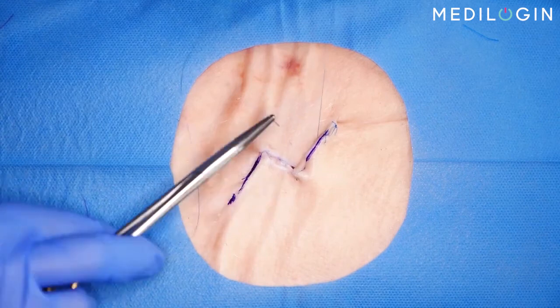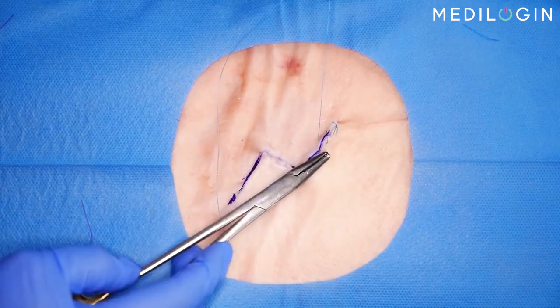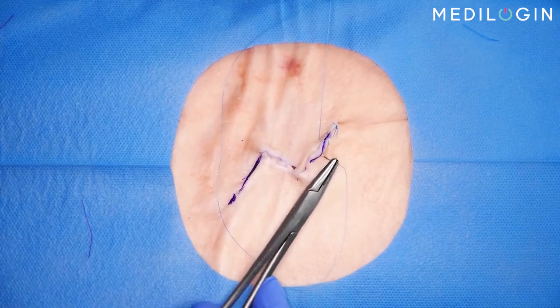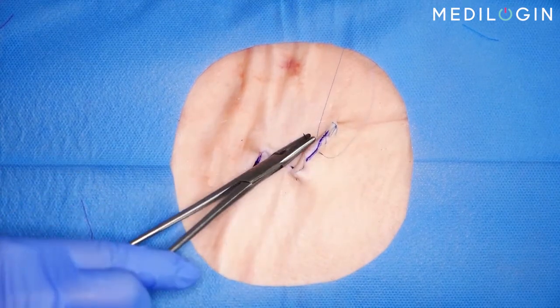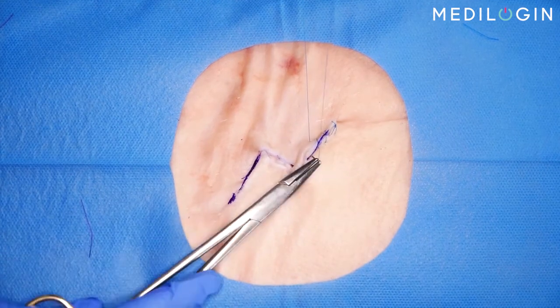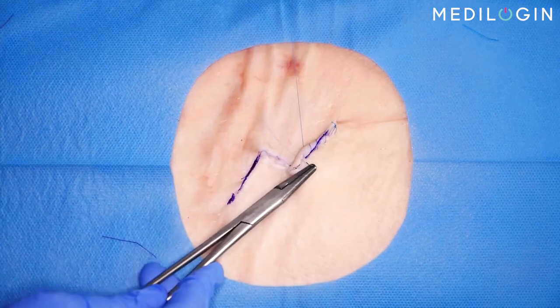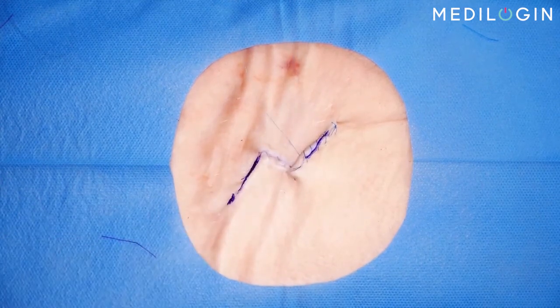The skin is penetrated perpendicularly and the needle passes through the epidermis and dermis. Through supination of the wrist, the needle exits on the opposite side at the same distance from the wound edge and at the same height. Here you can see the execution of the continuous suture in a time-lapse video.